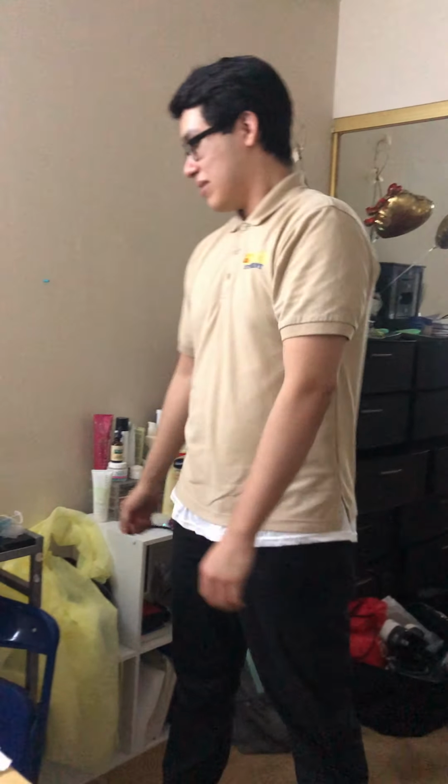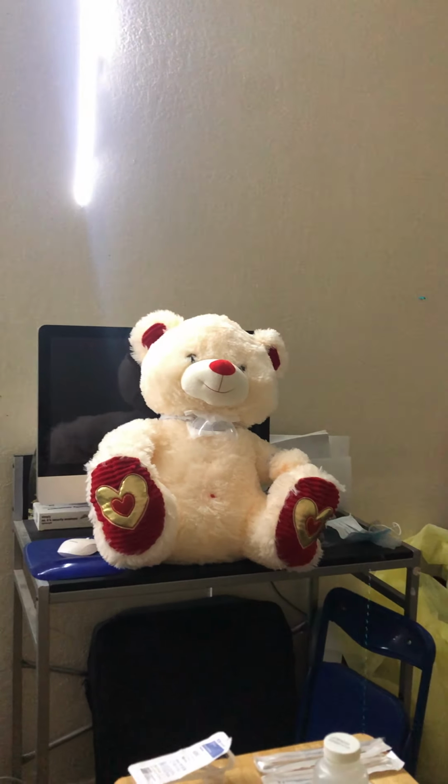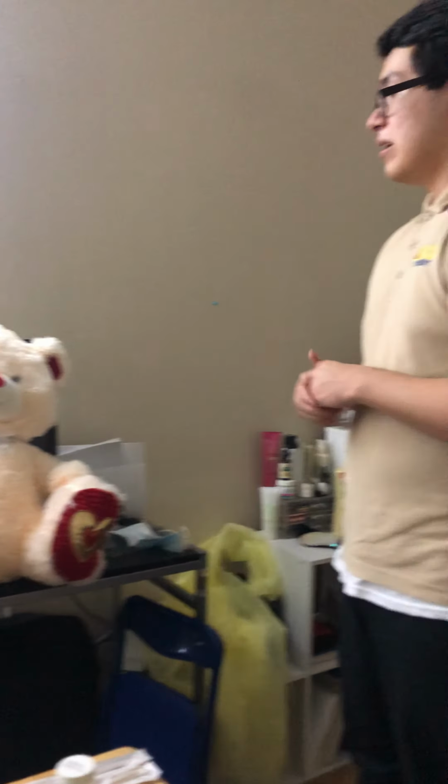Okay? So, hello, my name is Brian. I'm going to be your nurse for today, and today I'm just going to be performing tracheostomy care. Before I begin, let me provide privacy and hygiene. Make sure an obturator is near his bedside in case there's difficulties with his trach and your cannula.